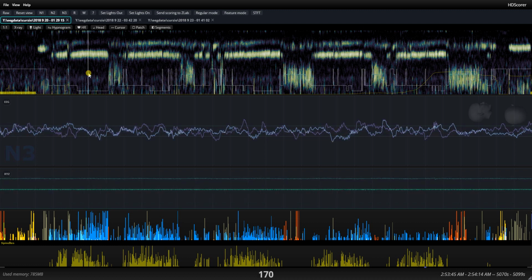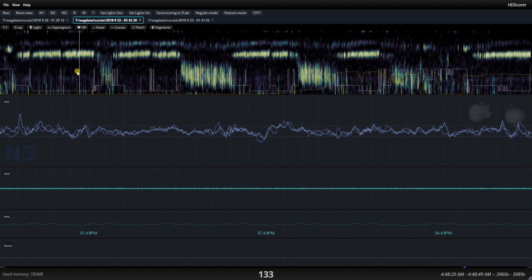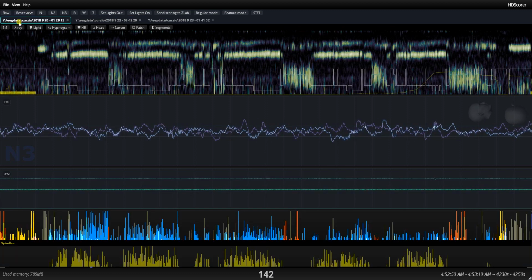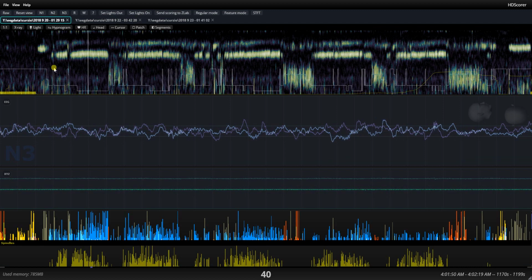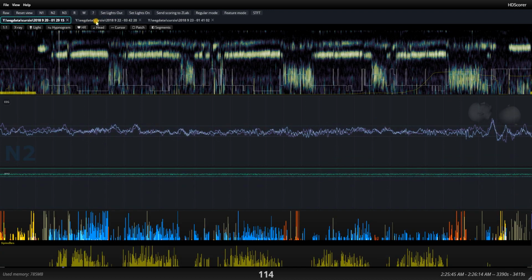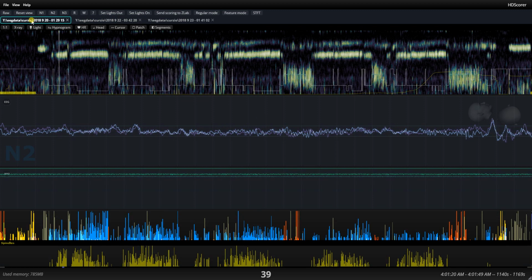The next thing you can do is take another record from the same subject and check out what N3 looks like here. To get the display to work exactly the same way, I go back to X-ray on this recording as well. I go back and forth between this and that, and I'm able to verify that N3 looks the same from one recording to the next. What about N2? If I move to about the same time into the recordings, maybe I see a little bit more K complexes here, but that's statistically to be expected. It's not going to be identical, but it looks very similar.